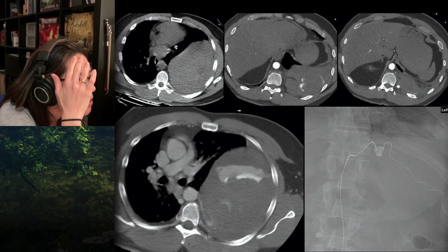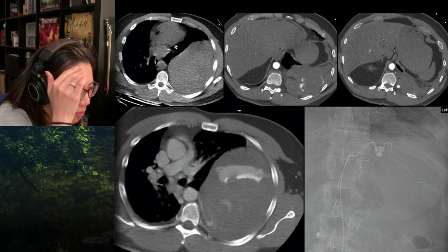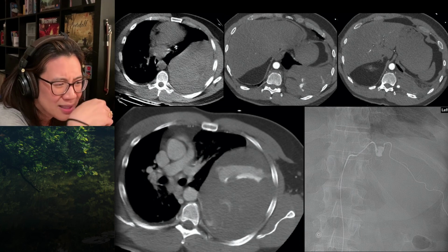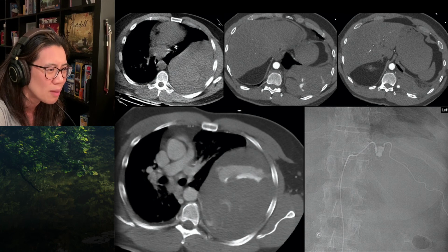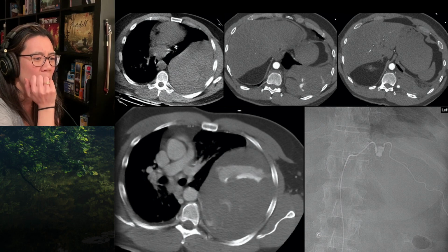Wow. So that's all blood. Is it bleeding from a posterior? It's bleeding from an intercostal. So there's an aneurysm of an intercostal vessel. How did that happen? Did they intervene? Did someone do something to this patient? This guy has had no trauma. He's had no intervention. He has had no surgery. He's a virgin body apart from this spontaneous ruptured intercostal artery aneurysm.